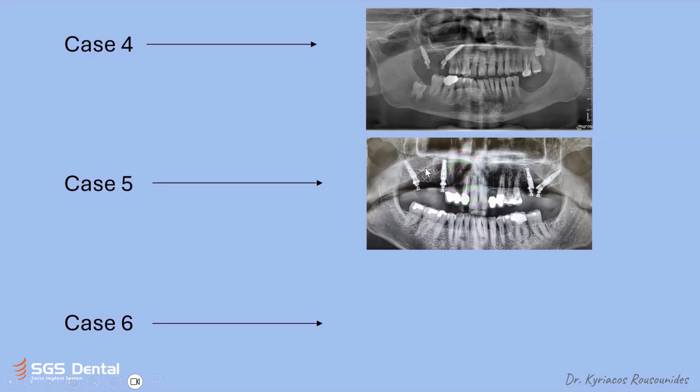If you had a sinus lift here and a sinus lift here, I wouldn't do an immediate loading with 6 implants if I had to insert 2 in the middle, because I would be stabilizing 2 implants in an augmented area, another 2 here in an augmented area, and only 2 in actual bone. To do also an immediate loading, from my point of view and my experience, would be a failure.